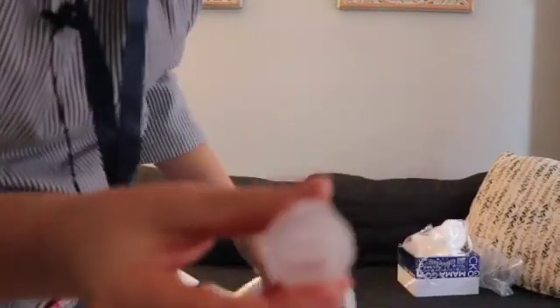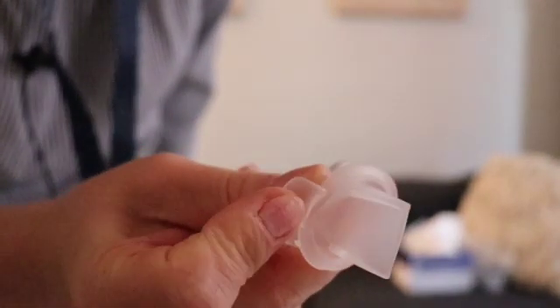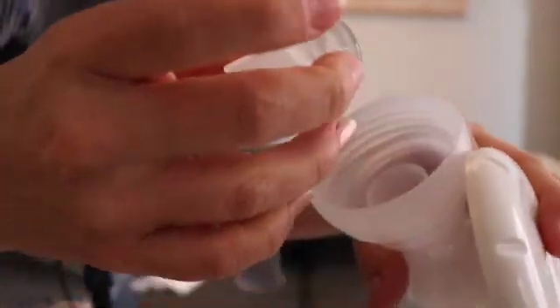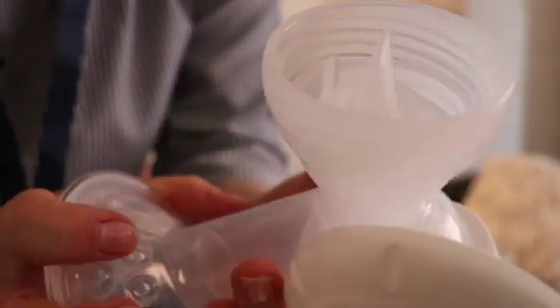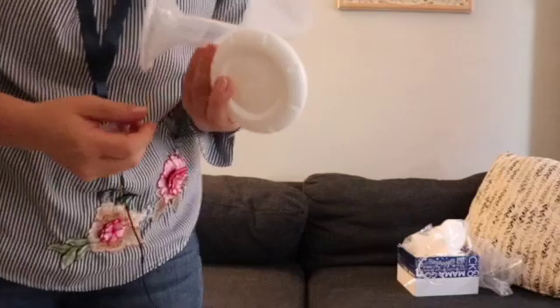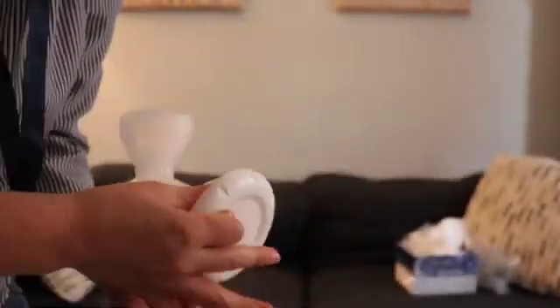And I'm going to put this up close so you can see it actually has a little pull tab on it, which is different than other duckbill systems I've seen, so that when it's in the flange, it is actually easier to pull it out because you just pull on this tab. Pretty cool.